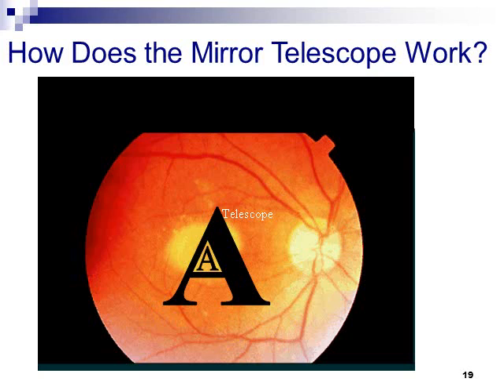So how does it really work? Well, every telescope, whether internal or external, works on the same principle. It creates a magnified image on the center of the posterior pole. The area of that image on the retina includes the degenerated macular area as well as a more peripheral area. This area has viable photoreceptors and can transmit the signal to the brain. The brain knows how to fill in the missing areas so that the patient gets a full picture. So basically the question is if the projected image is reflected on a large enough area so that it can still generate an image in the brain. That is why patients with a larger area AMD cannot benefit from a specific telescope, and they need a higher magnification that will reflect on a larger area and thus enable them to recognize the entering image.